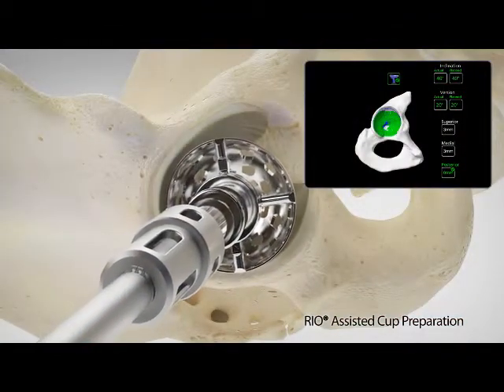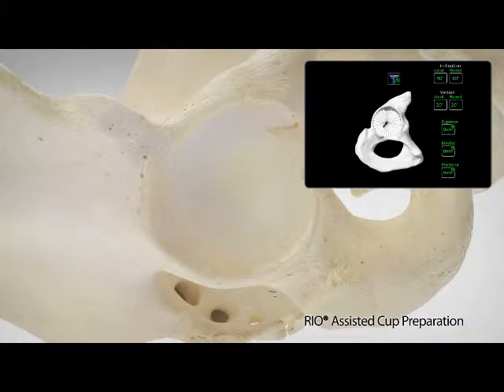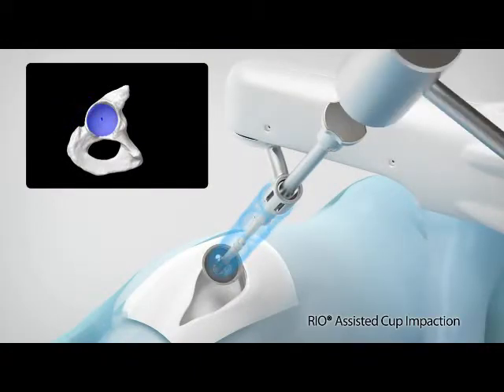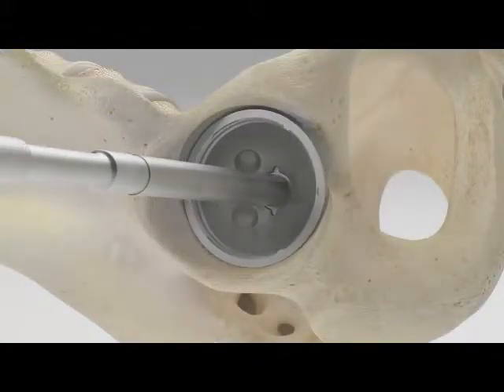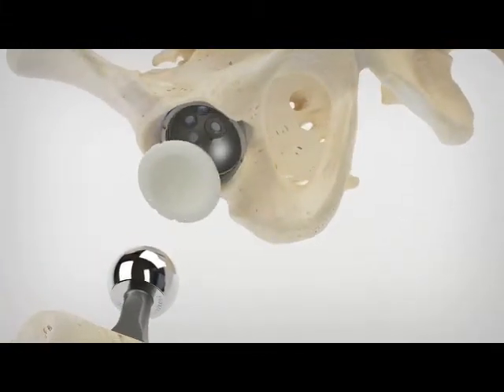The surgeon is assisted in providing accurate and controlled preparation of the acetabular bone to ensure the cup is placed according to the patient's unique surgical plan. The Rio-assisted cup impaction step of the Makoplasty procedure begins by easily switching from the acetabular reaming tool to the cup impactor. As the surgeon prepares to impact the implant into its final position, the Rio holds the acetabular cup at the desired inclination and version defined in the surgical plan.